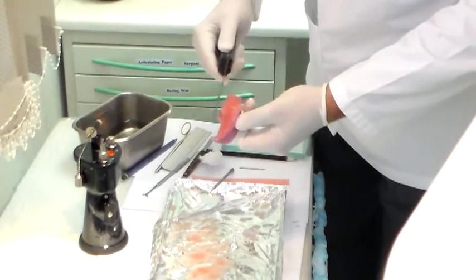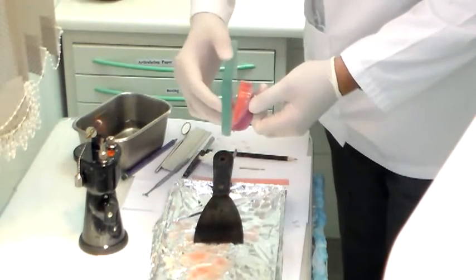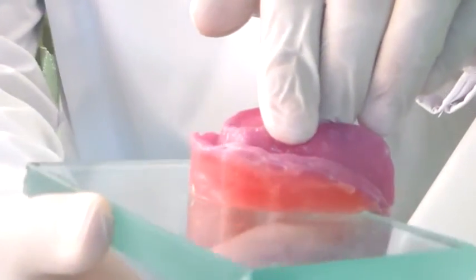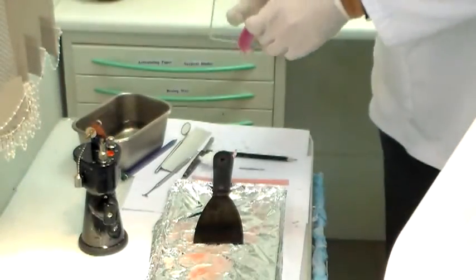I'm going to make sure of this first before I do anything else. I want to check also if my plane is okay. Alright, I think it's fine, and you want to go to the other side.